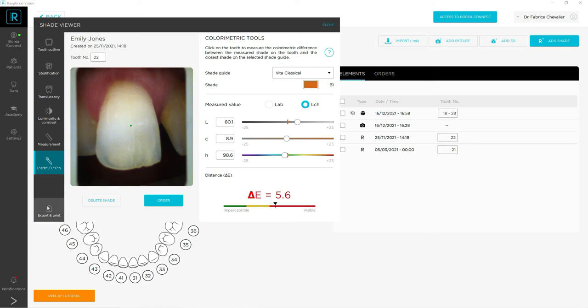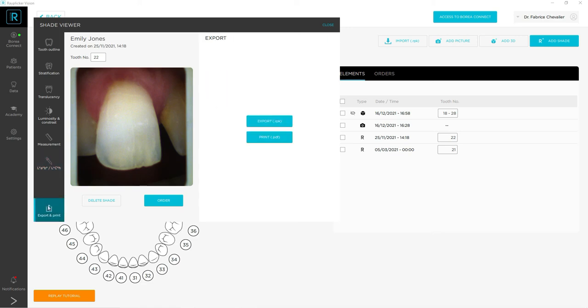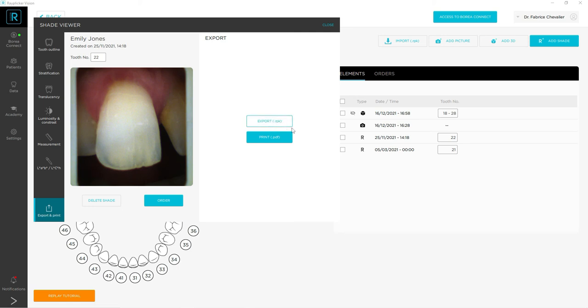Finally, you have a last button, which is the export one. You can export your shade in RPK, which is our source format, or you can export it in PDF and, for example, send it by email.